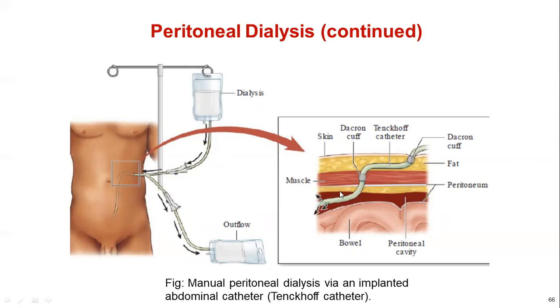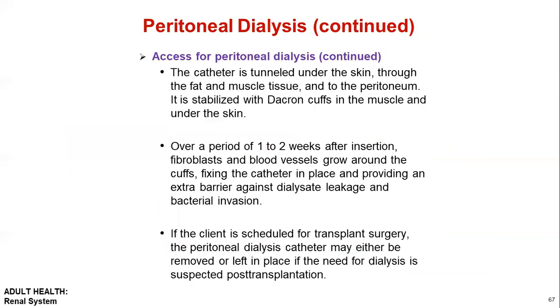This is called the peritoneal cavity. So you should insert the catheter and keep in mind there are some structures behind this membrane like bowel, urinary bladder, rectum. Better not to do it too forcefully, right? To prevent perforation.